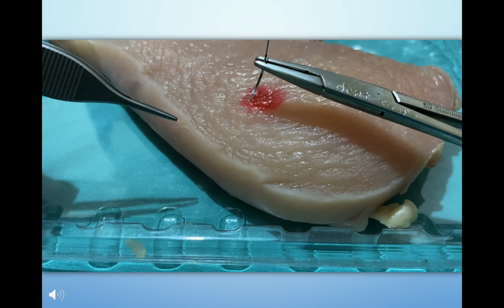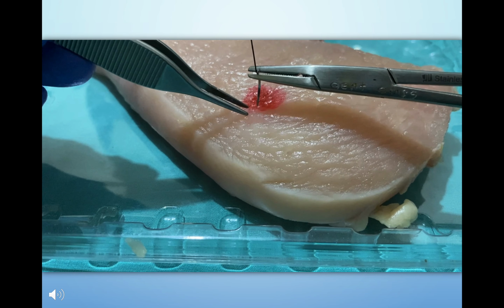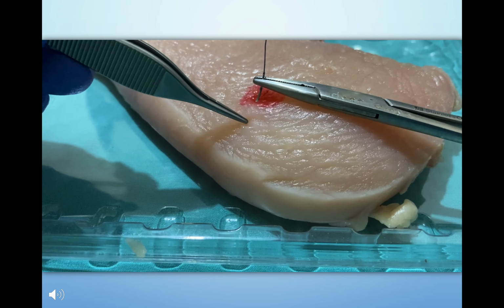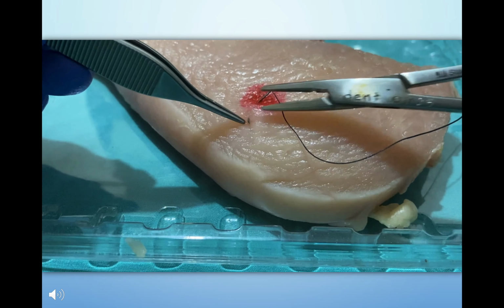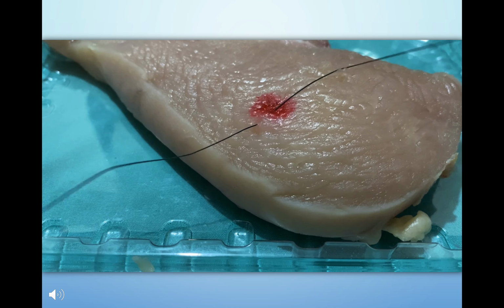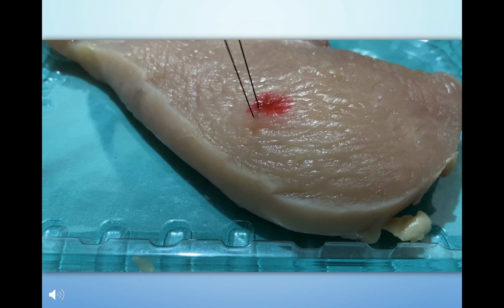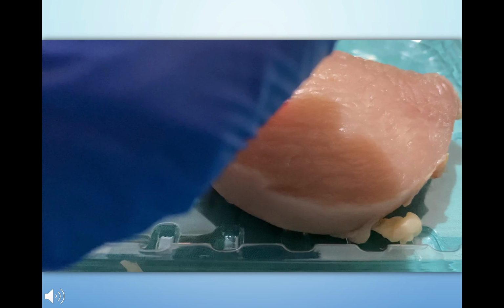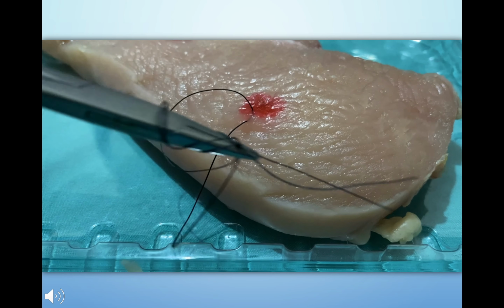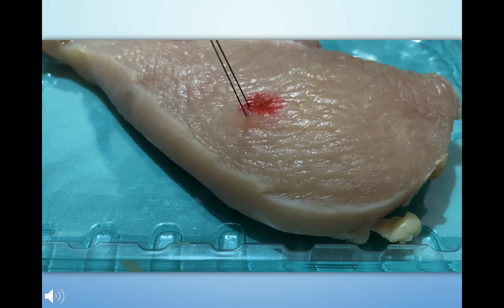Here's another technique of doing incisional biopsy. A suture is placed so that it can be easily held during the procedure rather than using a tissue forceps. So the needle is just placed across the lesion and then pulled. Then the suture is tangled around the beak of the artery forceps and pulled, and you can just continue with the incision in this way.